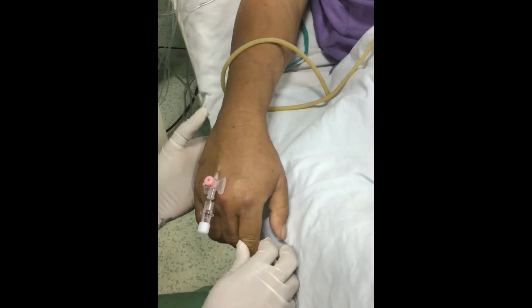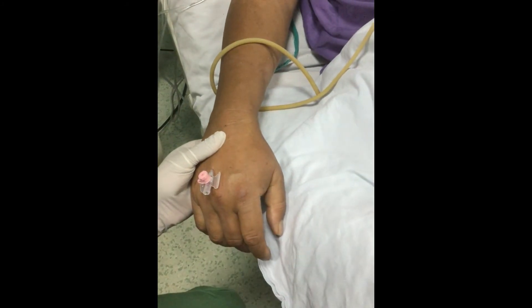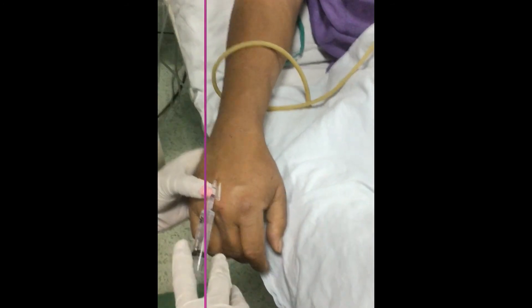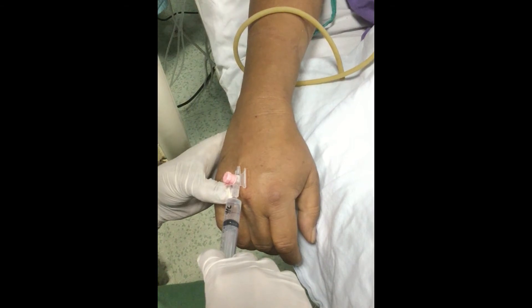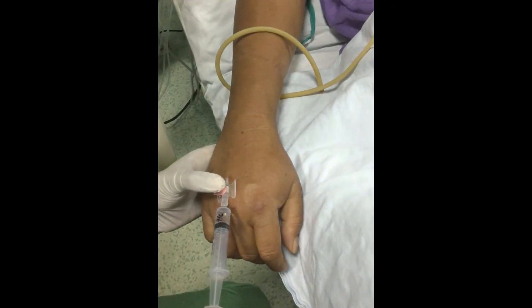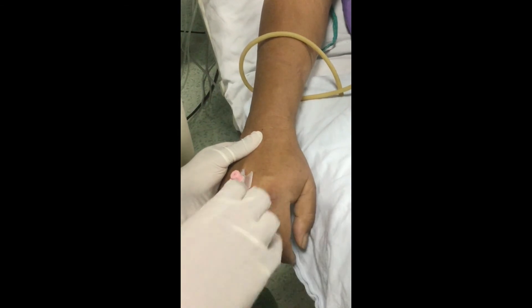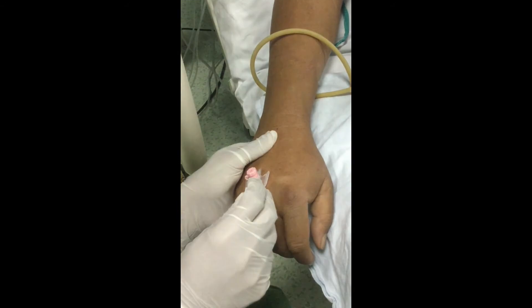Remove the tourniquet. Press at the end of the catheter and remove the needle, applying pressure so that there is no backflow of blood. Flush the IV cannula. While applying pressure at the end of the catheter, remove the flush syringe and apply the cap to the cannula.